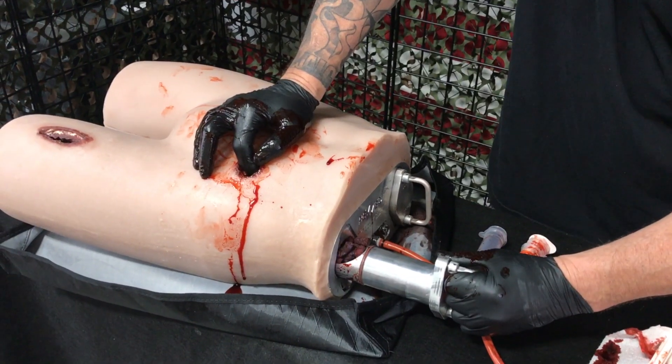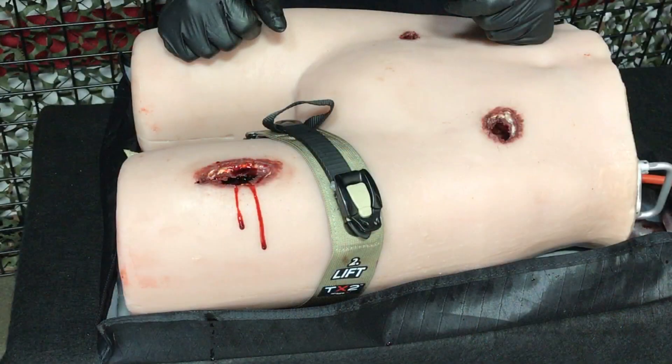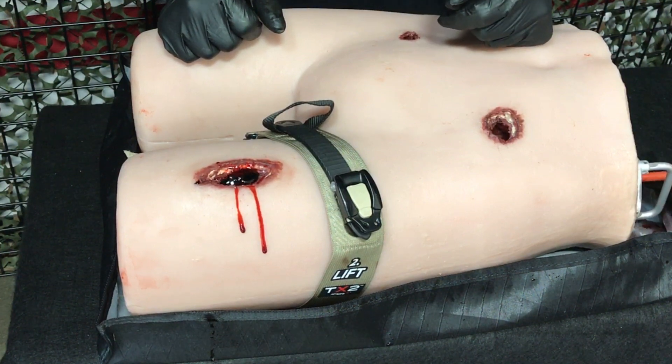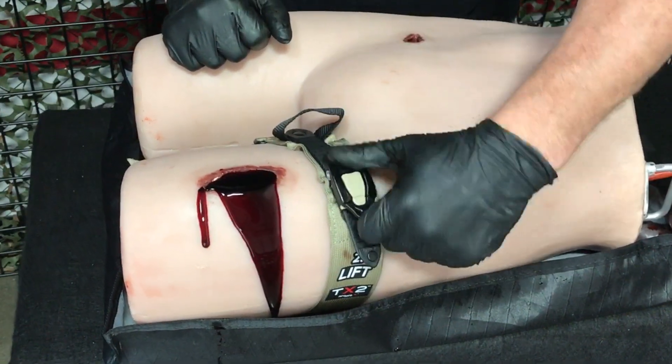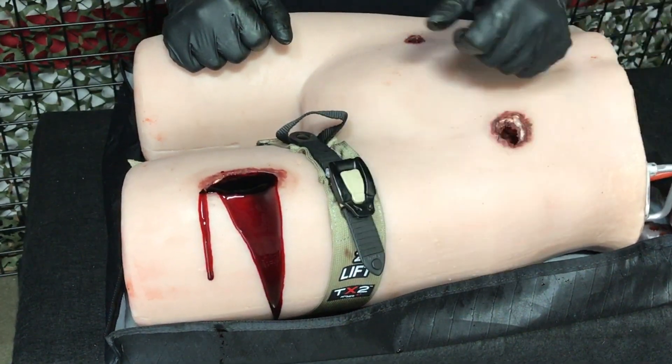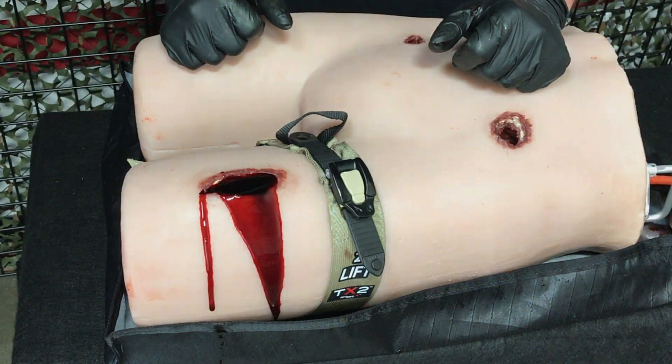Use and removal instructions for the large exit wound are identical. The thigh wound is not attached to a cylinder, as it is designed for training on wound packing technique and tourniquet application. To utilize the mid-thigh wound, connect your simulated blood to the appropriate connector. Apply your hemorrhage control device to control bleeding. Simply pour out the fluids to empty when you finish.